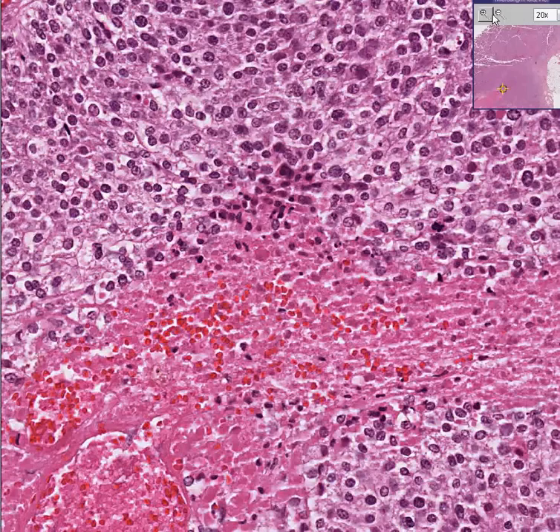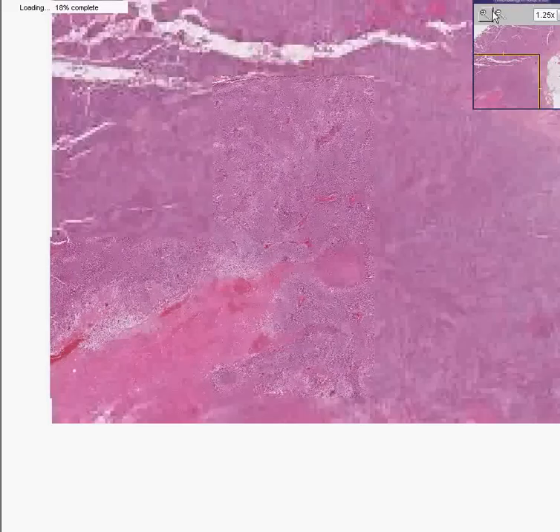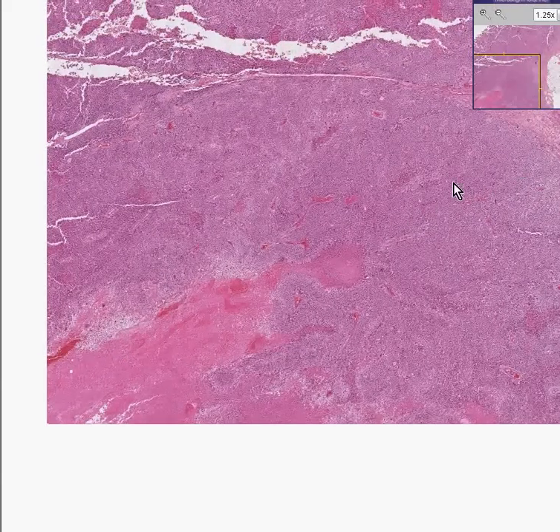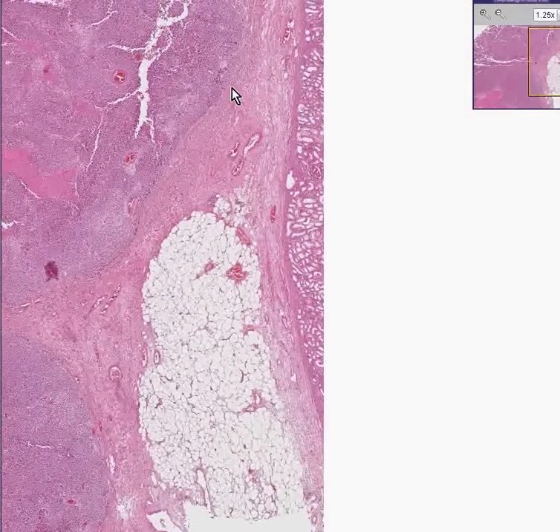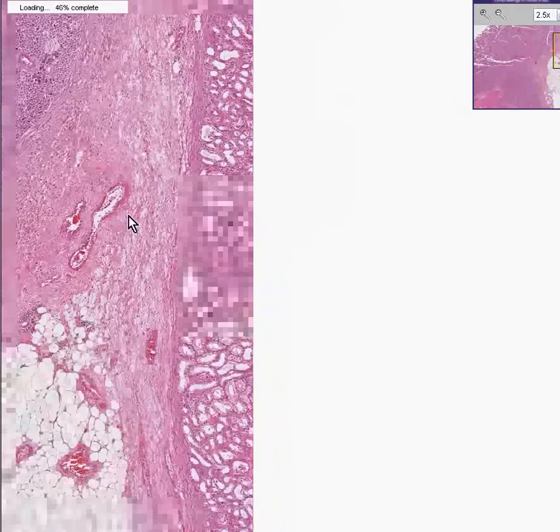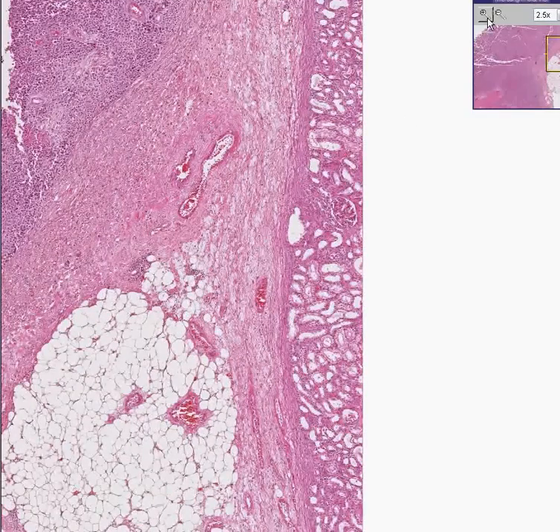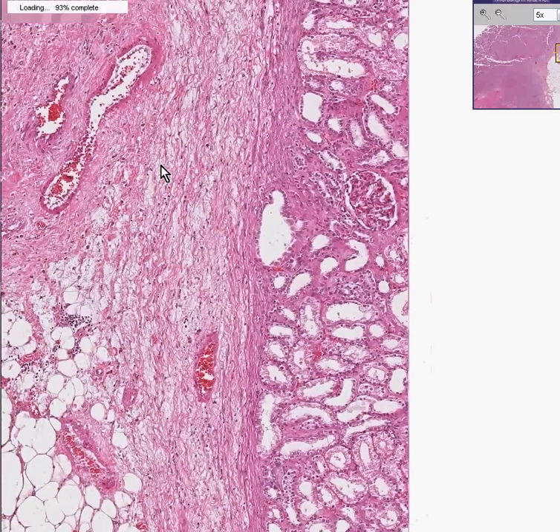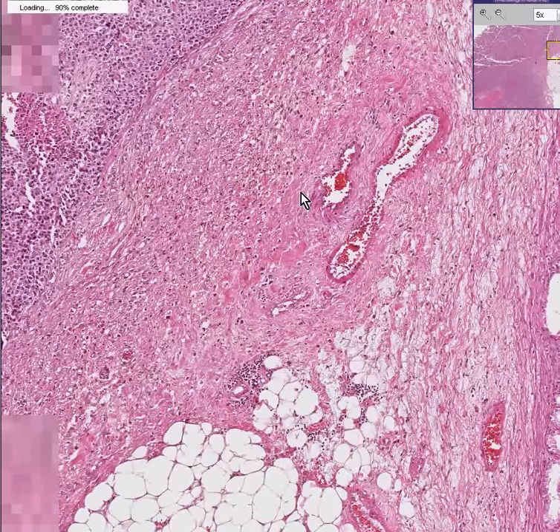The only real hint as to what this organ is is obtained if we cheated a little bit and went along the side of it — we could see some little tubular area here. We could see fibrous tissue, a capsule, and lo and behold, we could see a renal cortical glomerulus. So this was something that could very easily have been sitting right on top of the kidney like an adrenal gland.